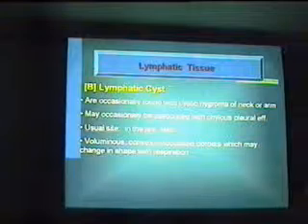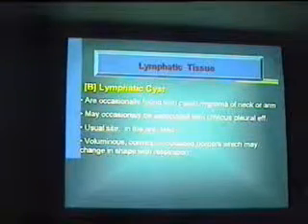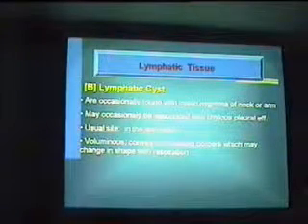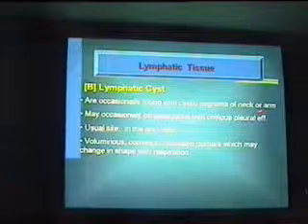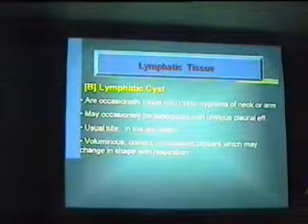صحيح it extends لما بتكبر قوي وترجع لورا، لكن because كمان the anterior mediastinum is narrow، مش زي البوستيريور mediastinum، مش زي lower aspect of the chest، فالاكستنشن من anterior posterior يبقى صعب شوية. ف being in the neck makes the extension to the anterior mediastinum more common.